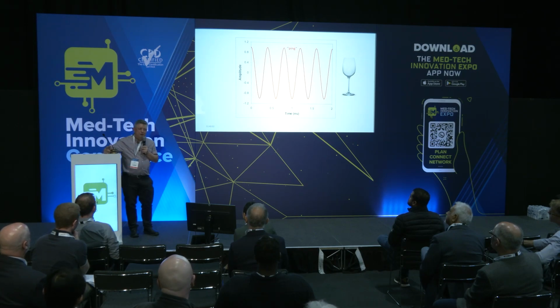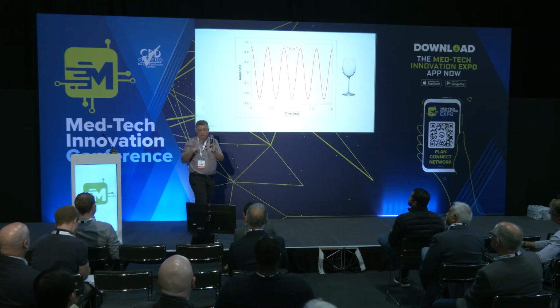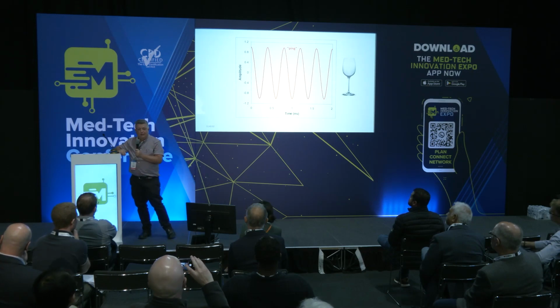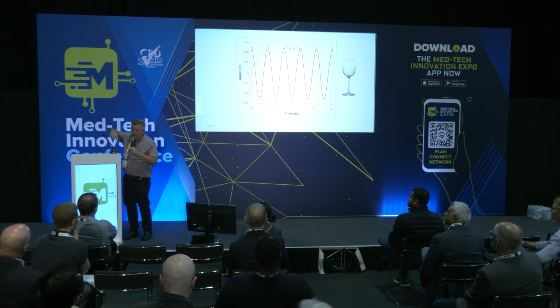That's called a high Q resonator, okay? Basically, it's a ping, isn't it? If you look at the oscillation of the bell, the oscillation carries on for quite a few seconds if you listen to it. And it'll keep going, all right? It'll dampen down eventually.